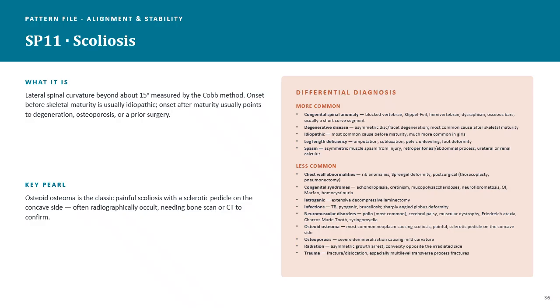If we look at the patient from front to back, if we were able to see through their body and look at the spine, it's a side-to-side curve, almost like an S versus a straight line.